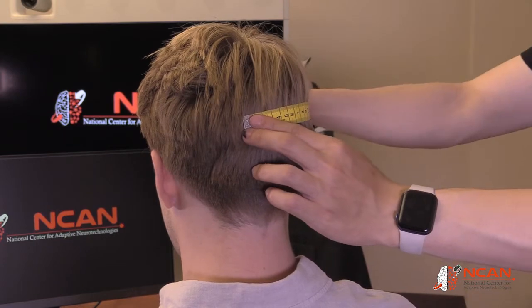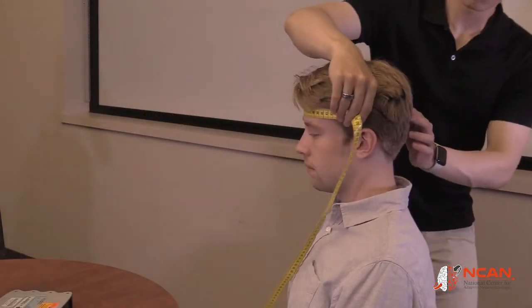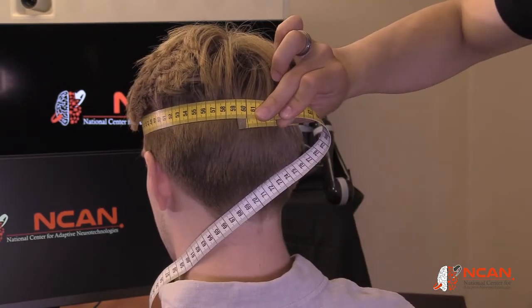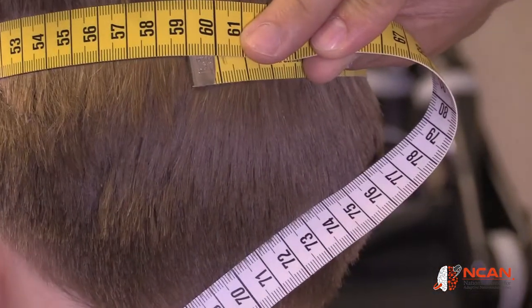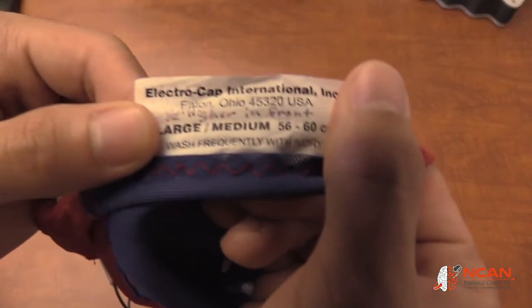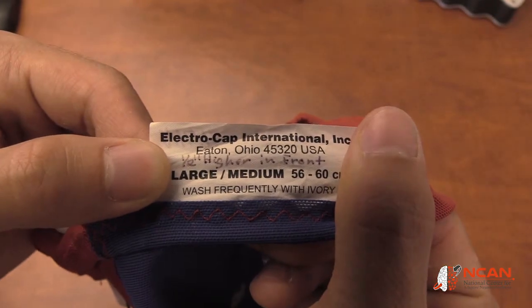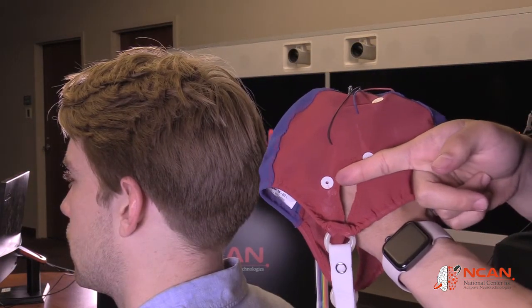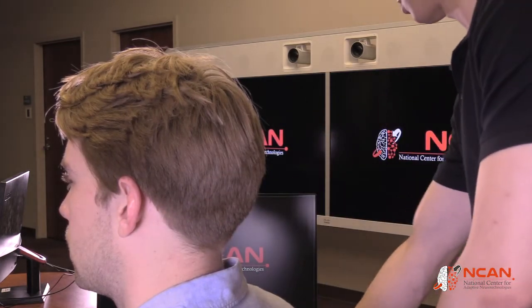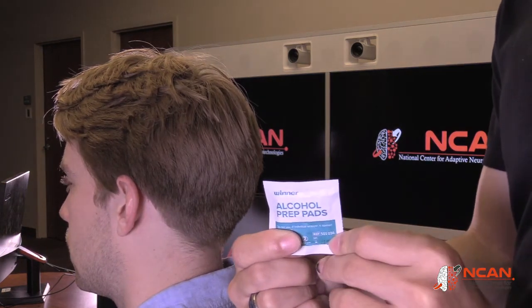To determine the size of the EEG cap needed, we measured the largest circumference of the subject's head. The reading is 59 centimeters. The medium cap is appropriate for 56 to 60 centimeters, so this is the cap we will use. On our EEG cap, there is 1 electrode behind each ear, one for the ground and the other for the reference channel. To ensure optimal conductivity, we clean behind the subject's ears with alcohol pads.